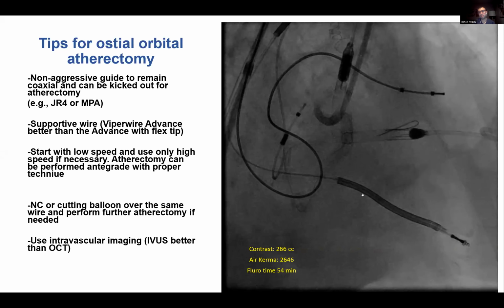Yeah, and I feel that this has been the standard that we've been doing. When you have a perforation, you try to get the guide liner as long as possible. You try to deliver your stent as soon as possible. And I have not seen the ping pong technique used a lot. Maybe with type 3 to 4 perforations when you have spilling blood and you want to stop it and you cannot deliver the guide liner and the perforation is so far down, maybe it would be helpful. But what do you think, Dr. Brilakis? Do you still use the ping pong technique a lot?